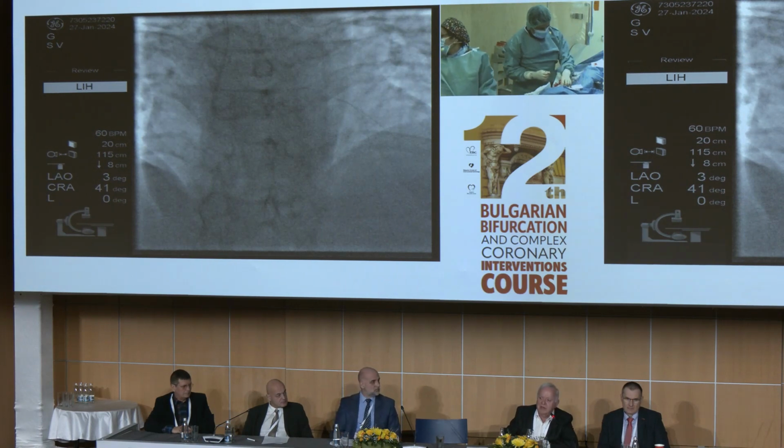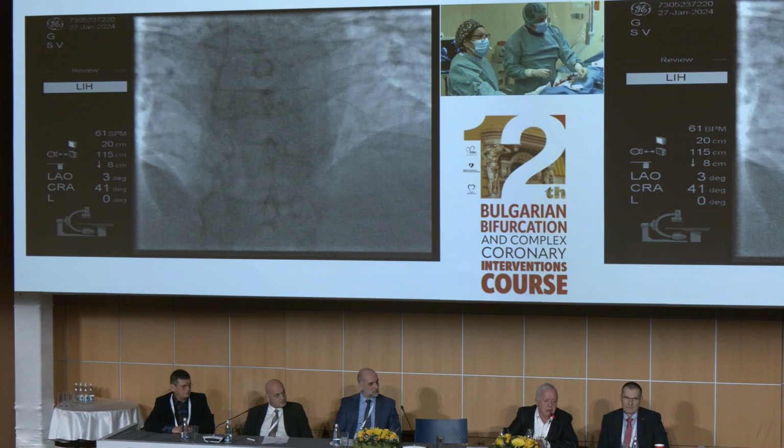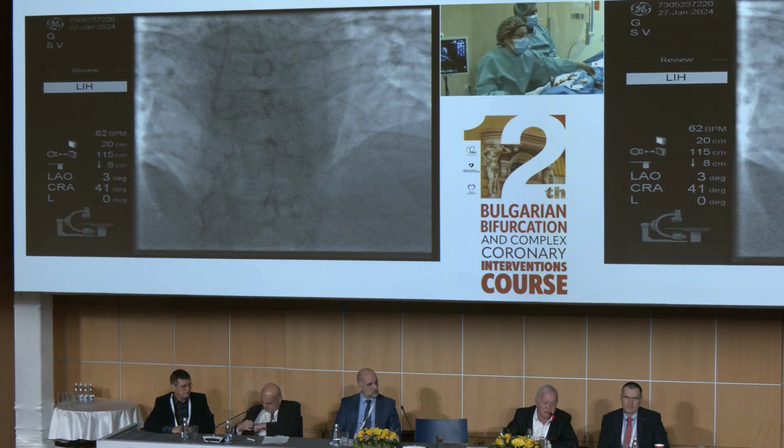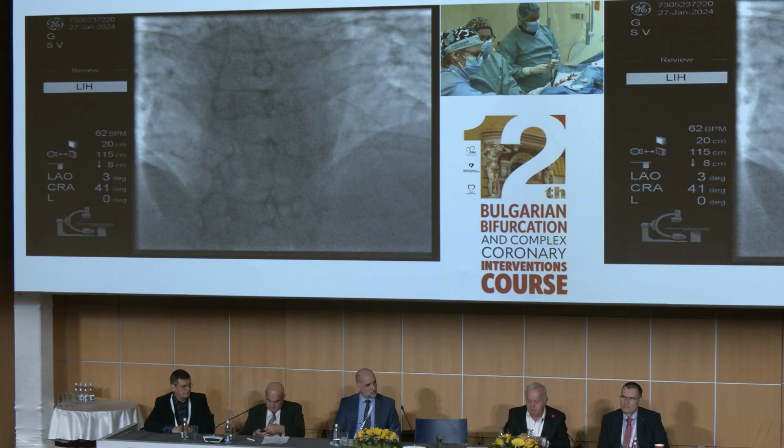During meetings, it is very interesting to show IVUS guidance and how precise it is, how we learn something we don't learn with angio. I agree with this. But if you cannot pay for intravascular imaging, you have to find other solutions. One is a small puff, another is a stent enhancement with 2 projections. You will see. Yeah.